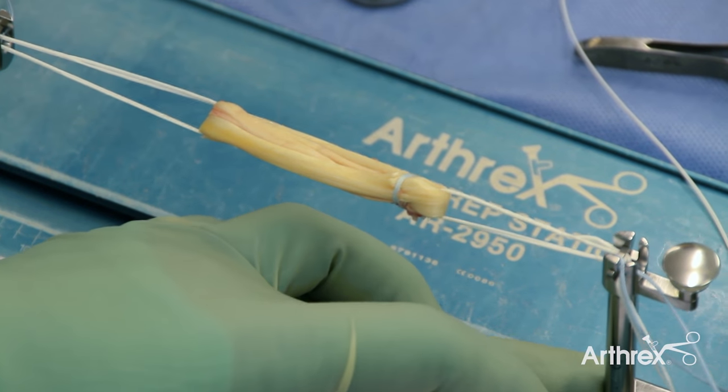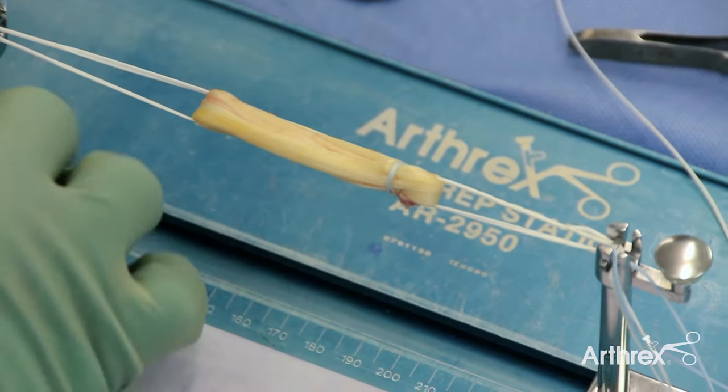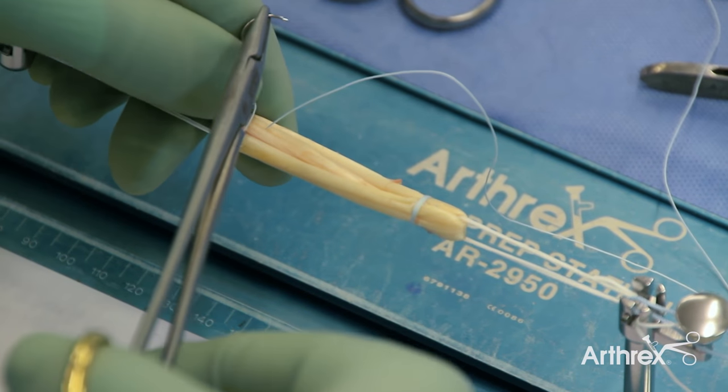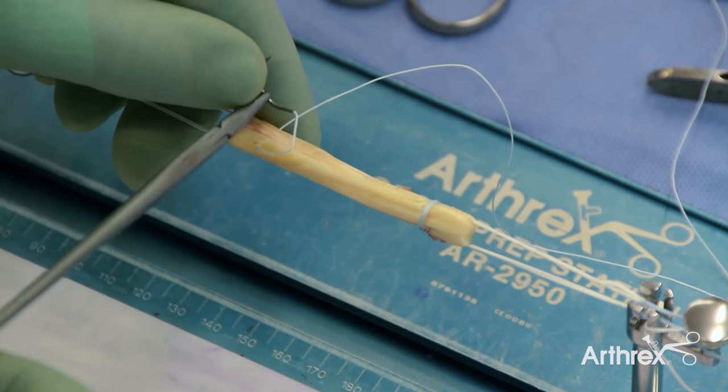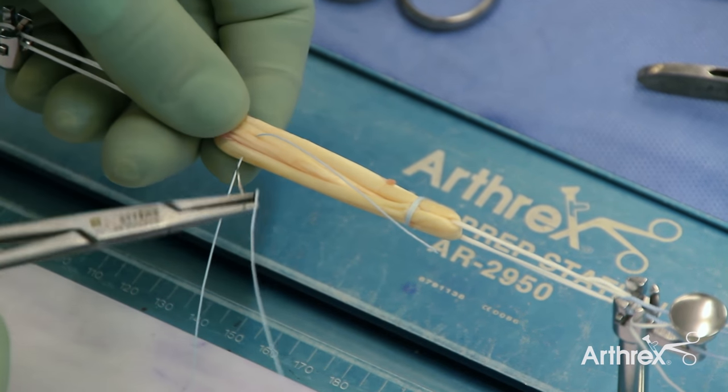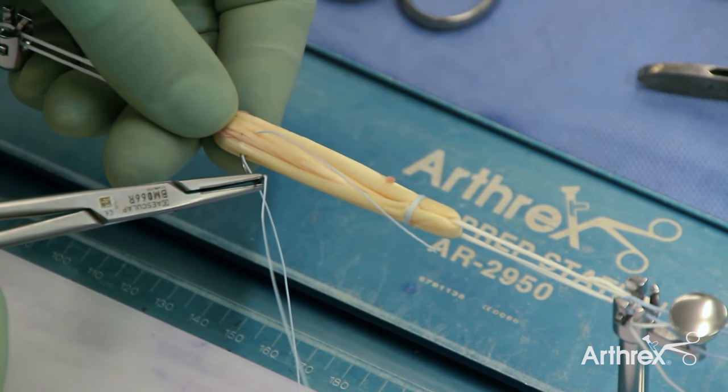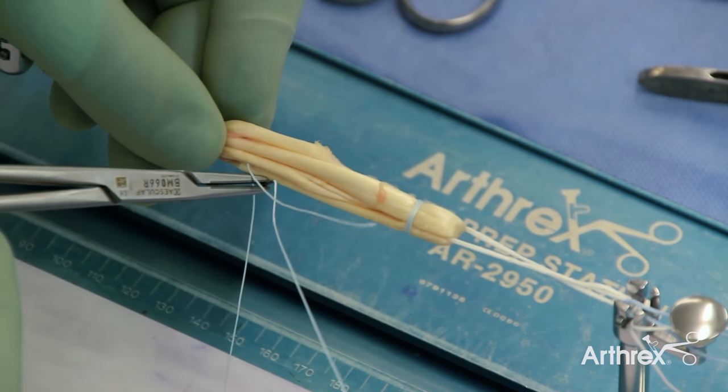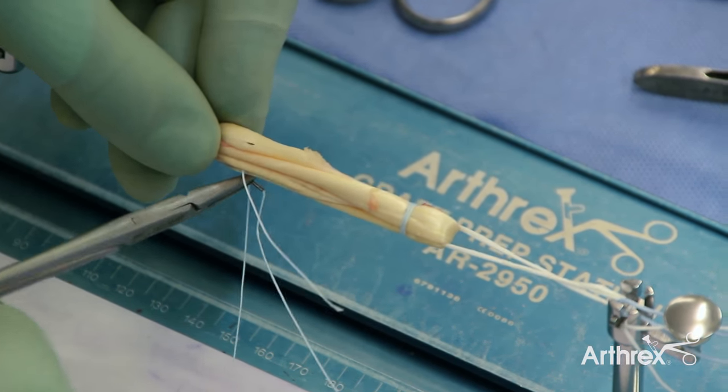Now the graft has been secured and we can start to apply tension. To finish graft preparation, the zero fiber wire is used once more at the other end of the graft, again starting on the inside and coming out, then going back through all four limbs.